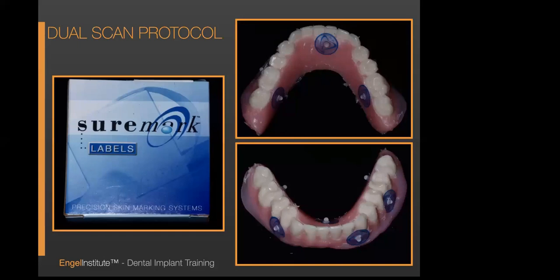This was just a quick reline here just to get the patient scanned. This was actually a wax up, so the patient was not going home with the denture, thus the edges not being completely clean. Now you can scan a patient in a wax up. You don't have to go to a complete denture. Essentially what we're looking for is the base rim. That's pretty much it.